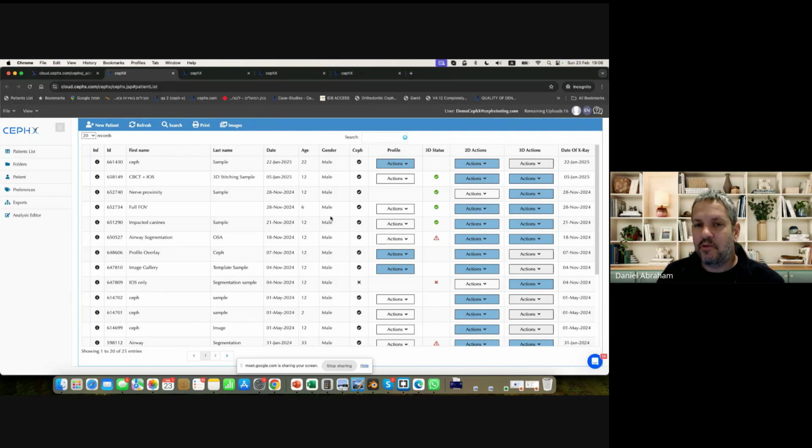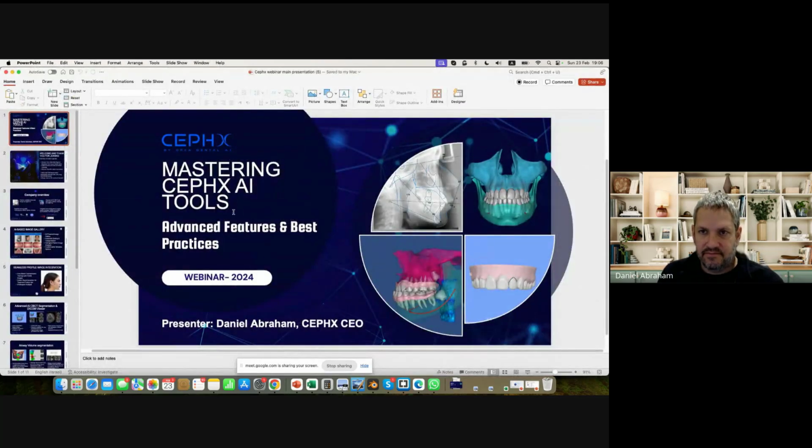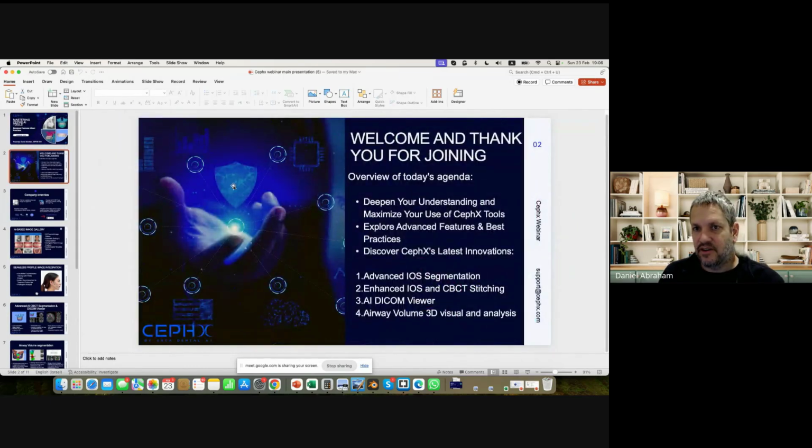And what we want to do is, since we've been working with the COP for quite a while, we thought it would be a good idea to discuss some of the options and maybe some of the less obvious tools that we have, and brush through some of the features within CephX. Let me just go over CephX a little bit, kind of an overview.